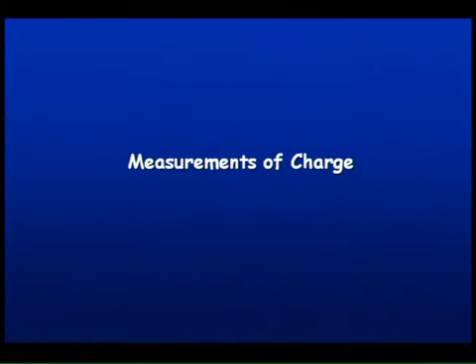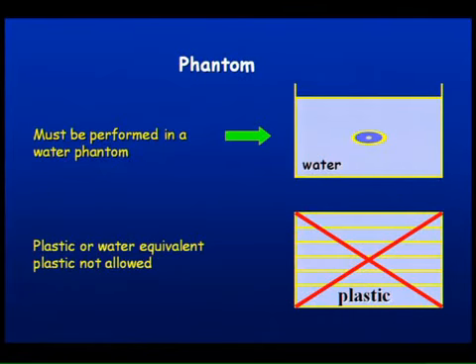Larry has spent a lot of time talking about some of the correction factors. I'll come to that. For chambers, the recommendation of the protocol is that all measurements must be performed in a water phantom. And plastic phantoms, including water-equivalent plastics, are not allowed for various reasons.